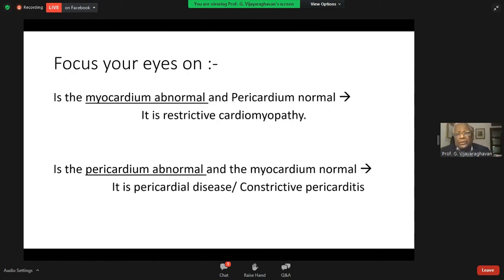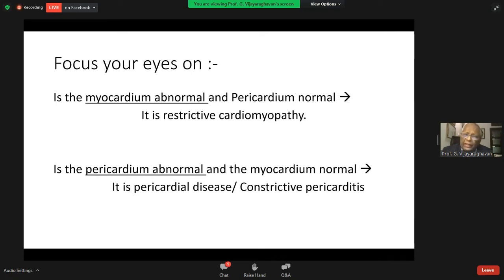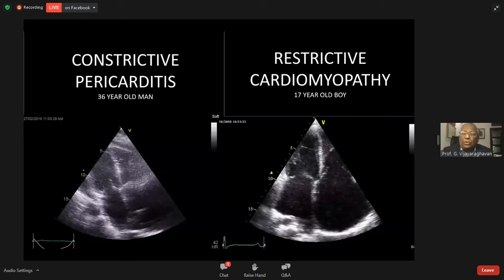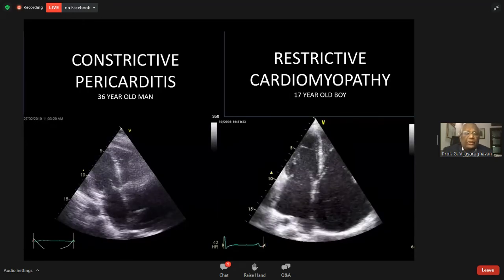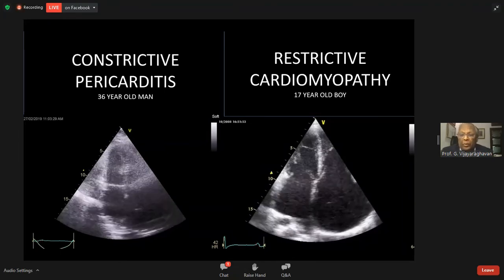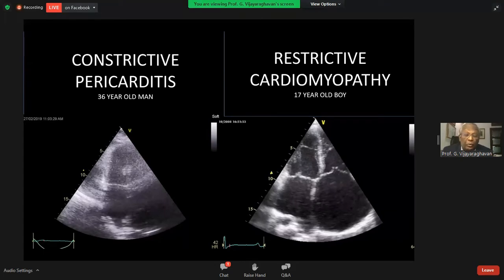I would request the echocardiographer to focus: is the myocardium abnormal and the pericardium normal? It is restrictive cardiomyopathy. Is the pericardium abnormal and the myocardium normal? It's pericardial disease — constrictive pericarditis. You can see the two varieties: the first is constrictive pericarditis, the second is restrictive cardiomyopathy.